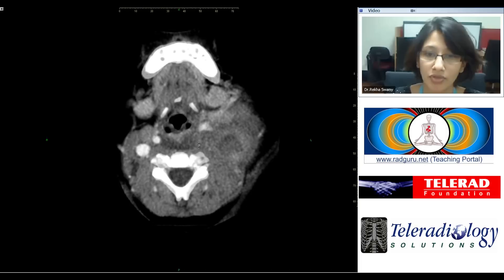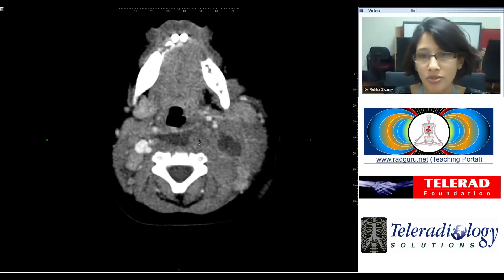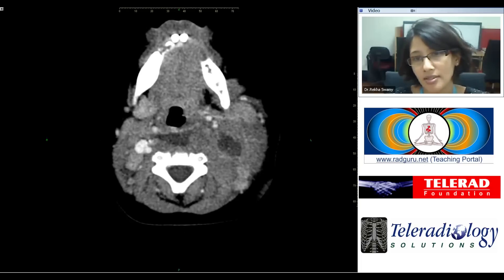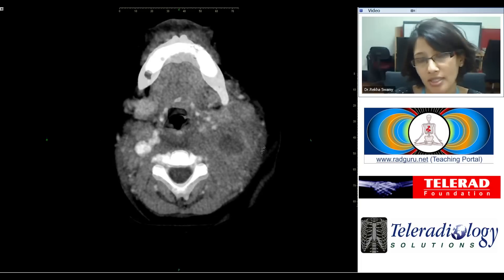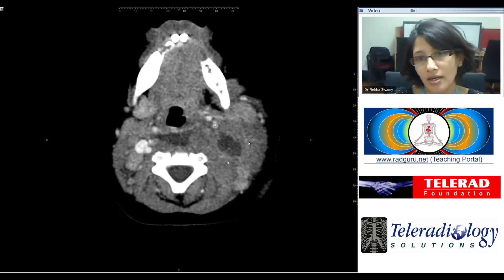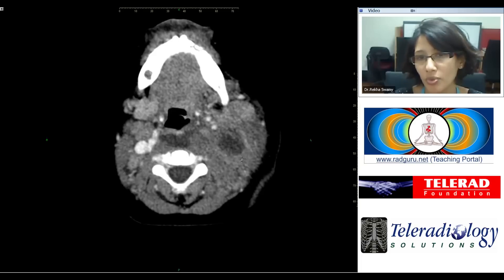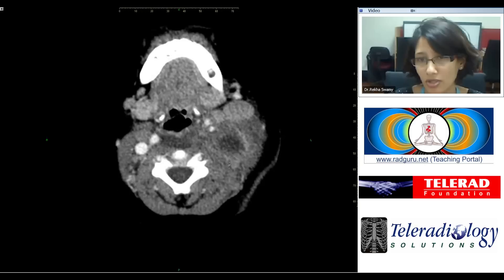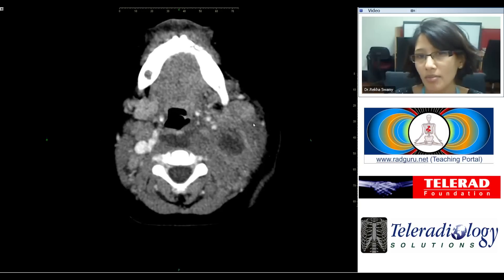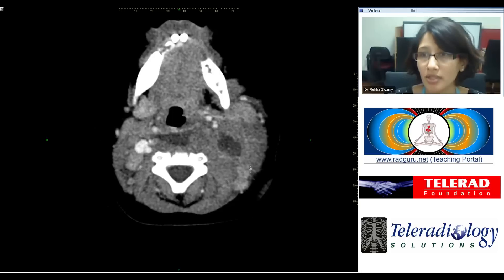The collection seen in the lateral aspect corresponds to a level 2 lymph node. There are additional lymph nodes visible here as well. Most likely this is a necrotic lymph node with the same infection as seen in the retropharyngeal space, and it is surrounded by a lot of soft tissue edema.